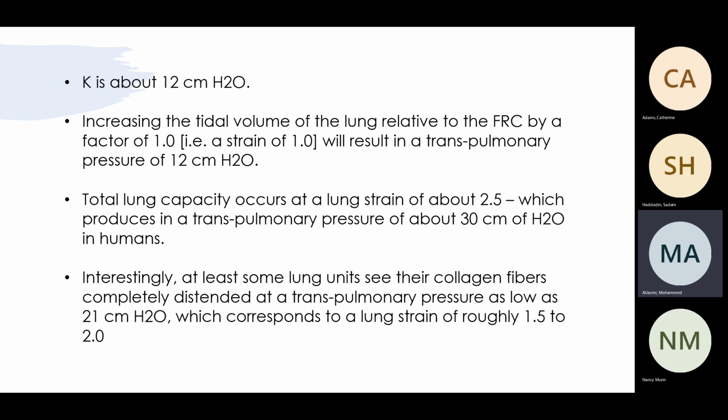The same during inspiration. I found that the alveolar pressure is much higher than the pleural pressure, which is a high risk of rupture. That word, much higher, what's the number we look for? We don't want the difference to be more than 20. Is that right? From where did they get these numbers, which is this relation between the stress and the strain? Okay, for the first time, maybe it will not click in your mind that quickly, but try to repeat again and again.